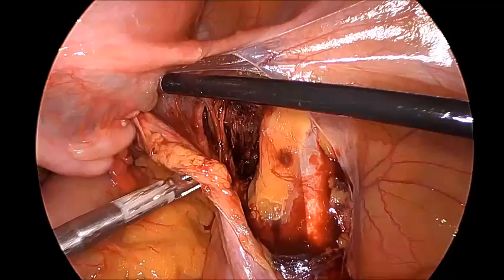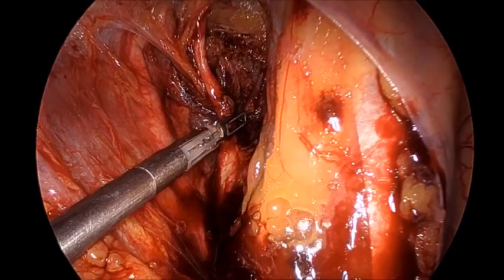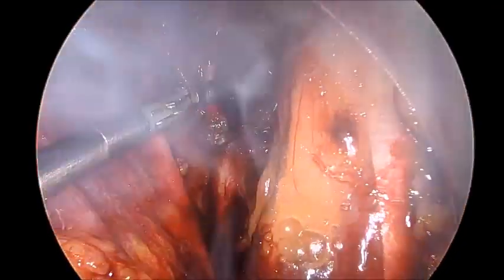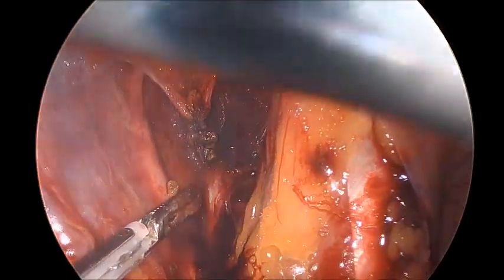Okay, now we are coming back to the anterior division of the internal iliac artery. We are coagulating the anterior division and also the first medial branch, that is the uterine artery.